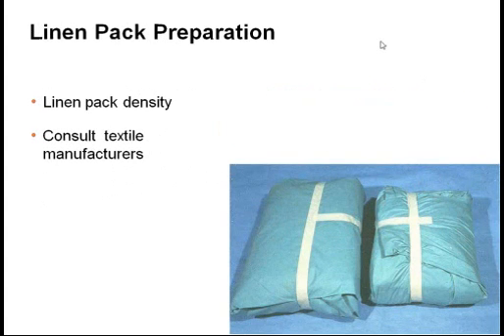When preparing linen packs, pack density relates to how the textile contents of a pack are arranged and how tightly they are wrapped. Linen pack preparation must be maintained within specific parameters during sterilization for proper air removal, steam penetration, and steam evacuation. Some textiles used for wrapping are water repellent rather than water absorbent. Consult the textile manufacturer for preparation and sterilization instructions. Textiles made of water repellent material may need to be wrapped in an absorbent towel prior to wrapping in non-woven wrap or other non-absorbent wrappers.